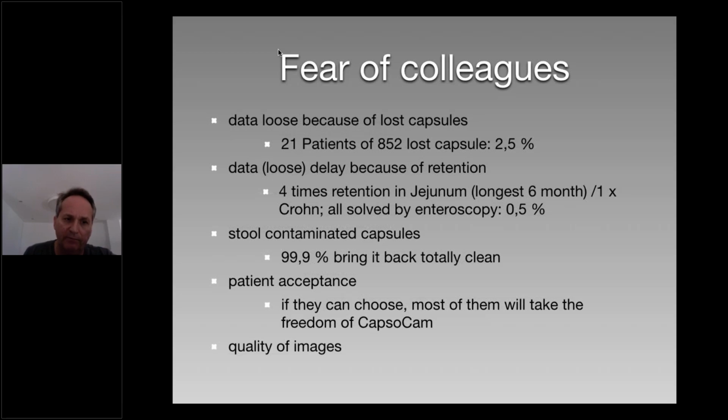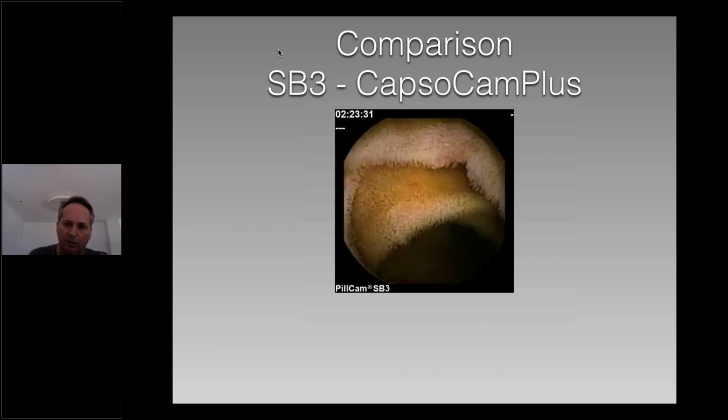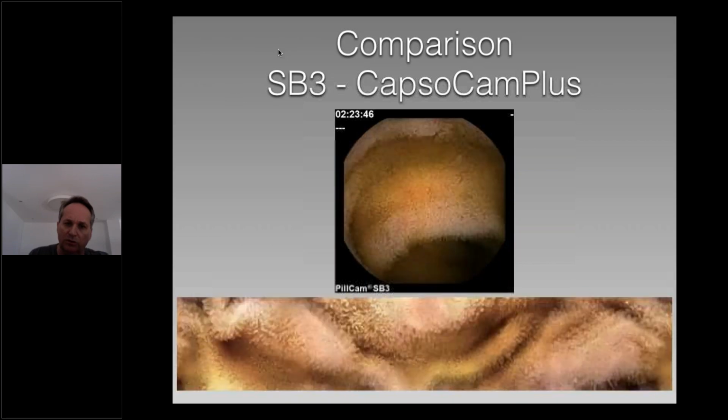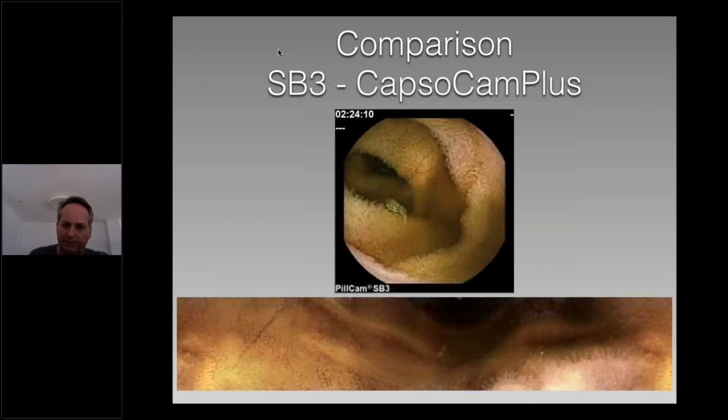And another fear is the quality of images. And I will show you a comparison with the leader on the market, the PillCam SB3. All of you know these brilliant pictures, and you see also an examination with the CapsoCam Plus.